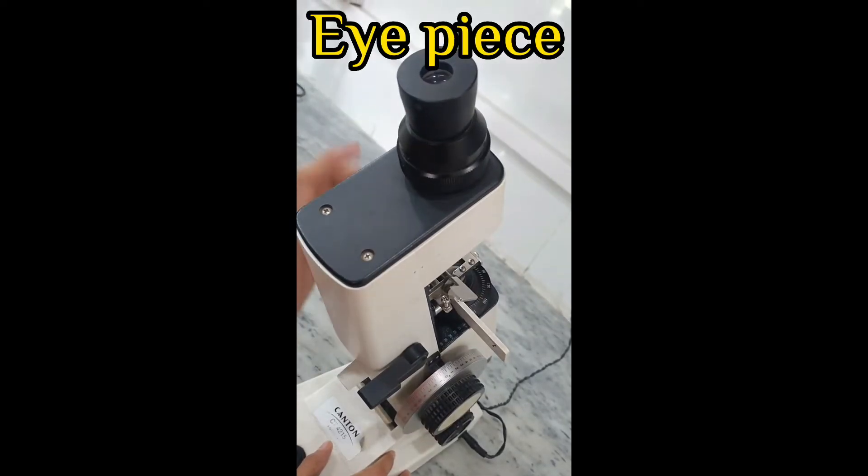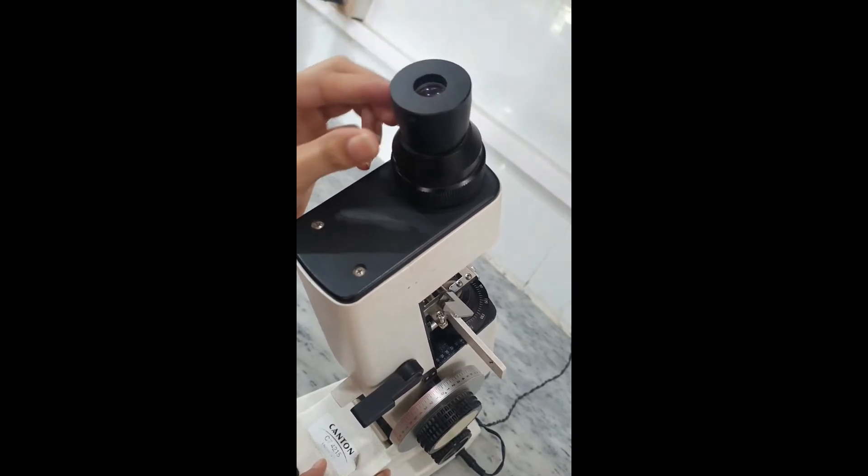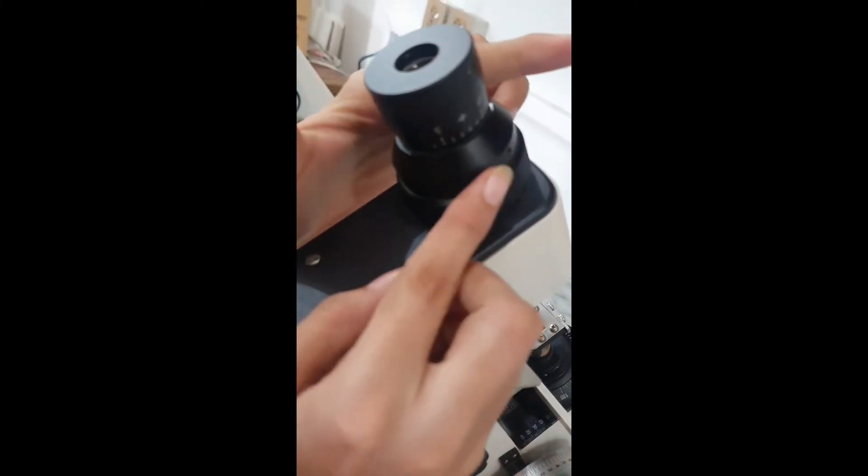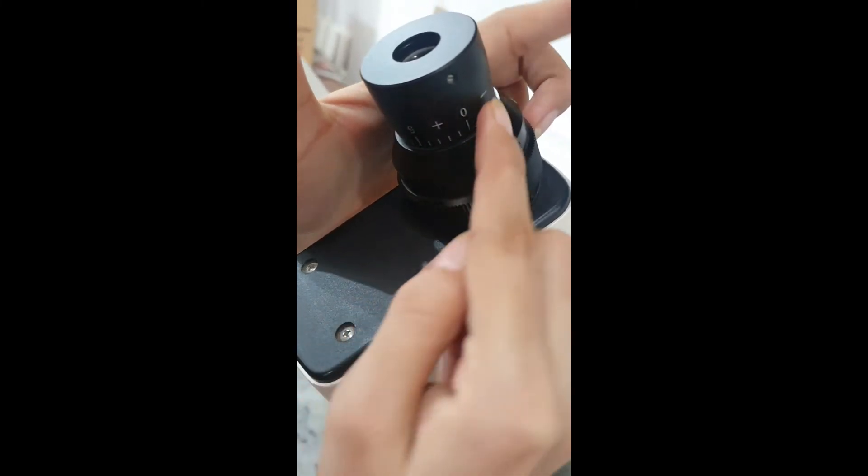Eyepiece - for adjusting the instrument according to the examiner's eye. The eyepiece should be focused manually till the reticle becomes clear.